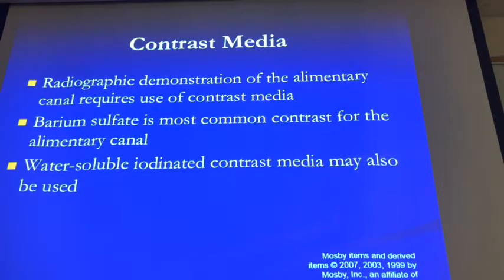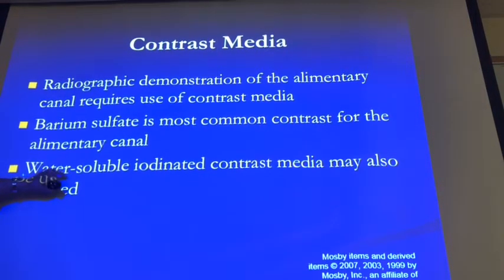So what is the significance if it is water soluble? It will be absorbed. Let's imagine that the patient had a perforated bowel and contrast media sneaks out of it. They don't have to operate. They might, because if there's fecal matter there, they might need to go in. They might just treat it with antibiotics, but they don't have to go in and look for where the contrast media is, because the iodine will be absorbed. Make sense? So that's the difference. If a perforated bowel is suspected, then iodine will be used.